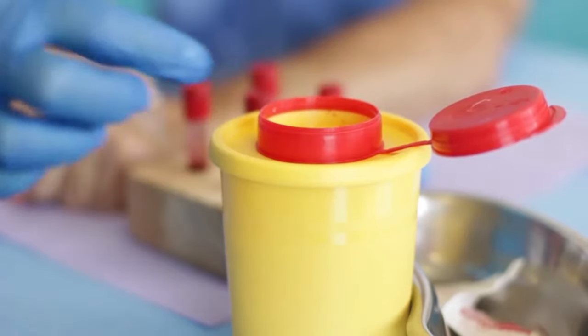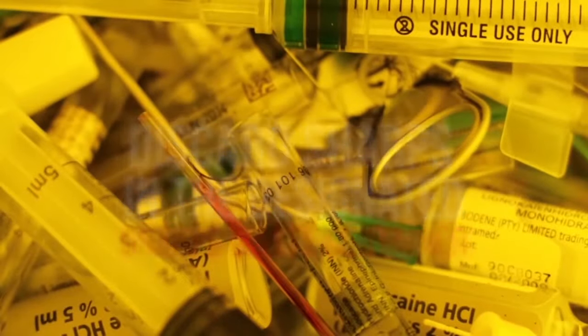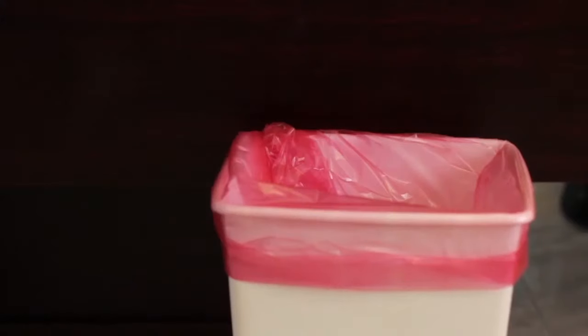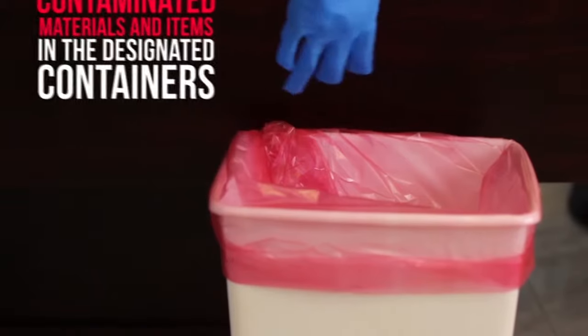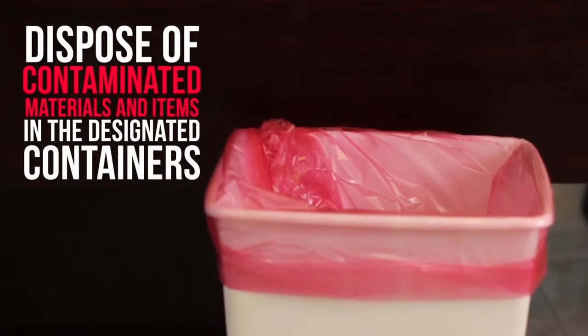Discard sharps, the used needles, broken glass, and syringe or blood sampling device into a puncture-resistant sharps container. Place items such as used gloves and all items contaminated with blood or bodily fluids into the infectious waste.